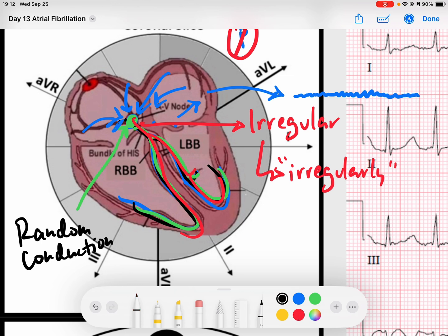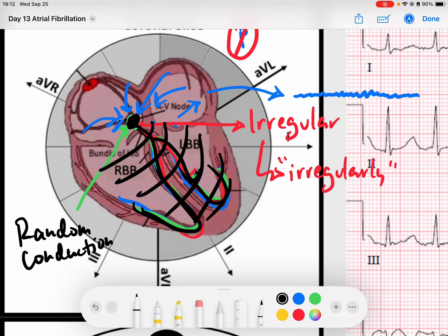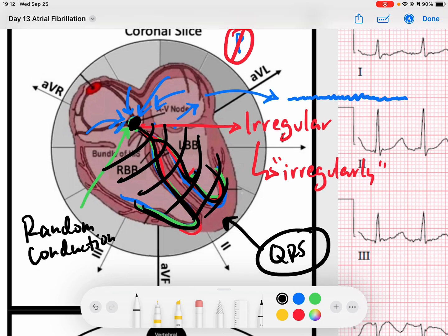The AV node is going to conduct the QRS complex. Notice now that once the AV node does capture that signal and sends it down, we should have normal QRS morphology. The QRS morphology itself should be unchanged. In AFib, we need to identify this as AFib. We also need to assess ventricular depolarization independently.